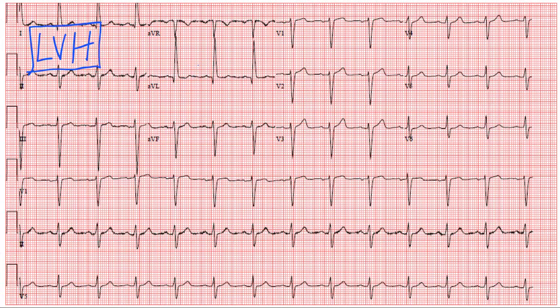So there's a number of different standardized criteria that one can use to diagnose LVH. Oftentimes, providers just look at the lateral leads, V5, V6, or AVL, and say, the R wave or S waves look big, it's probably LVH. But there is formal standard criteria, and they should be used when diagnosing LVH.